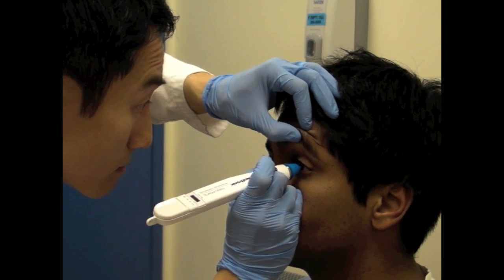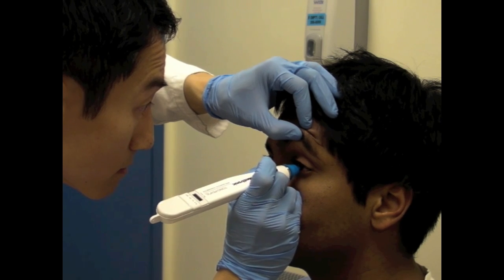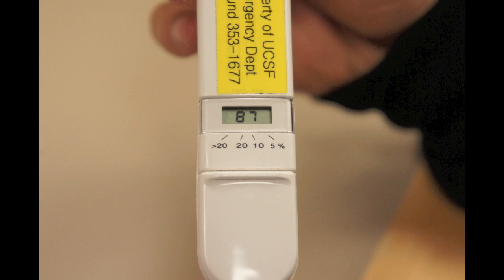Remember to take measurements by touching the probe tip to the cornea, using the lightest and briefest pressure that will obtain a reading. Repeat this several times, as you will hear some smaller clicks before a louder beep. This louder beep indicates that the tonometer has taken enough measurements to average into a final reading.